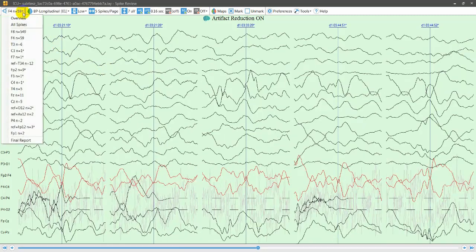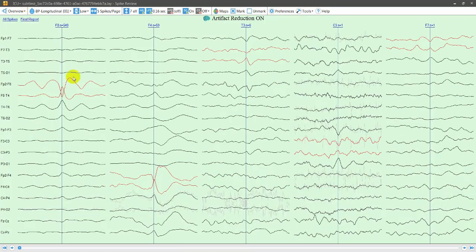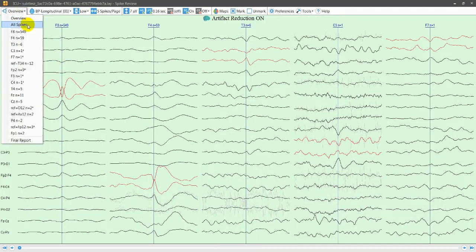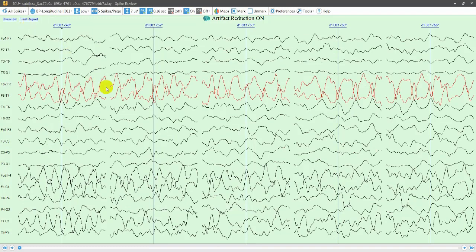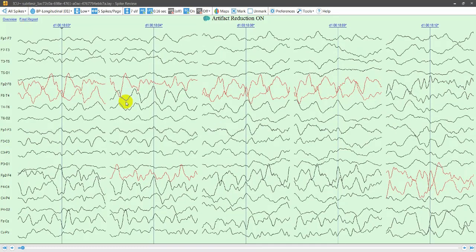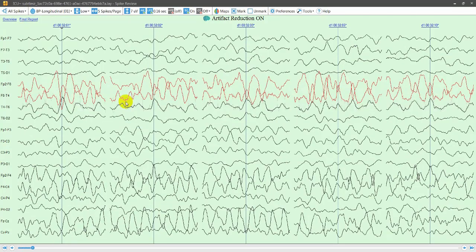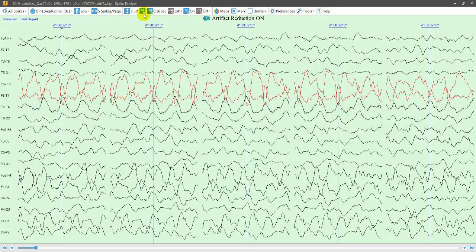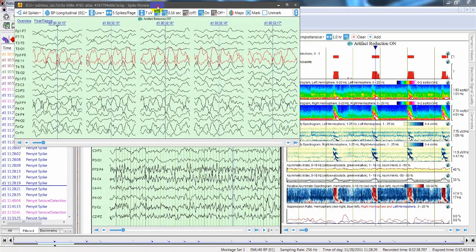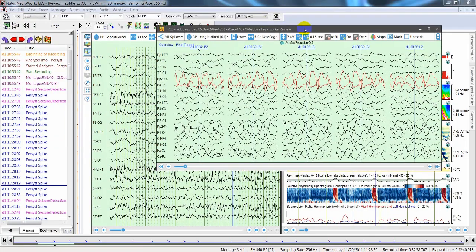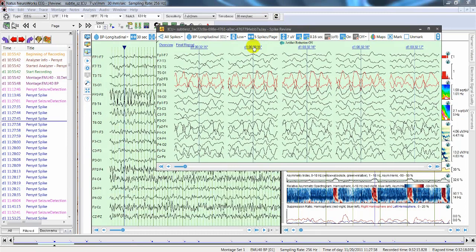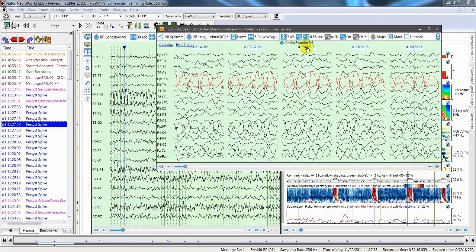You can go back to the overview to select different electrodes — for instance, F4 — and review all spikes detected at that electrode. You can also select the All Spikes view, which shows all detections. If you are interested in finding a specific spike in the recording, click the timestamp at the top of the spike and the system will immediately jump to that page in the EEG.